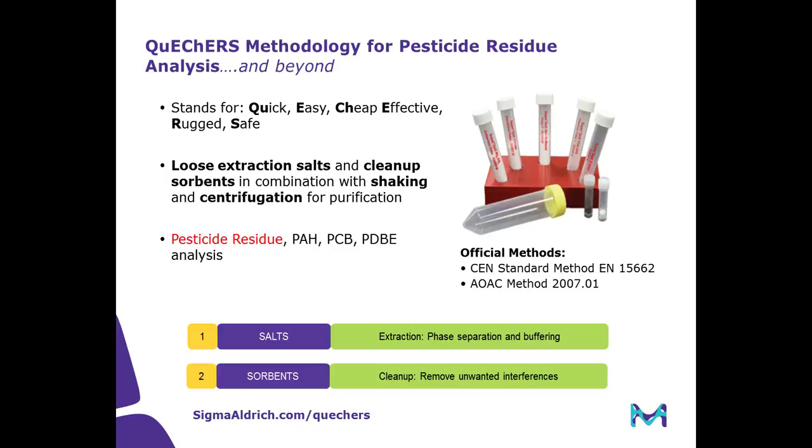There are two official methods that describe this technique. One is in the AOAC, and the other is a European method, and they're listed on the right-hand side of the slide.